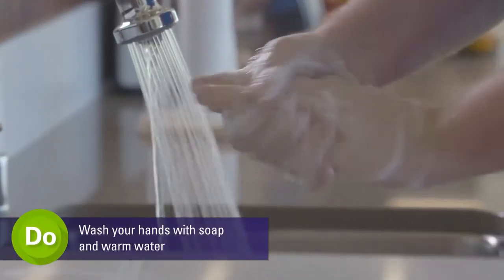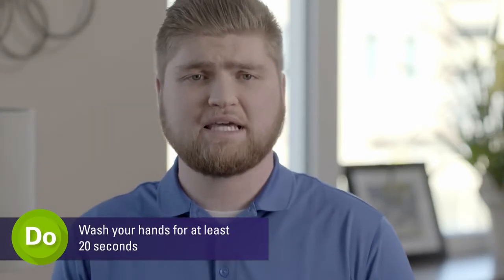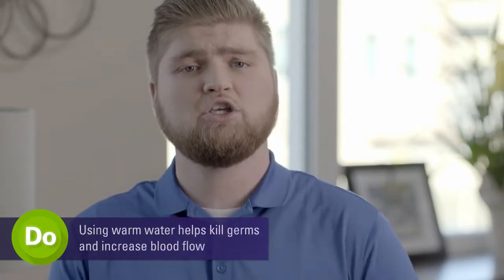The first step in performing the blood test is to wash your hands thoroughly with soap and warm water, then dry with a clean towel. A tip I like to use is to count out loud for 20 seconds as I wash my hands. Using warm water also helps increase blood flow to your fingers before testing.